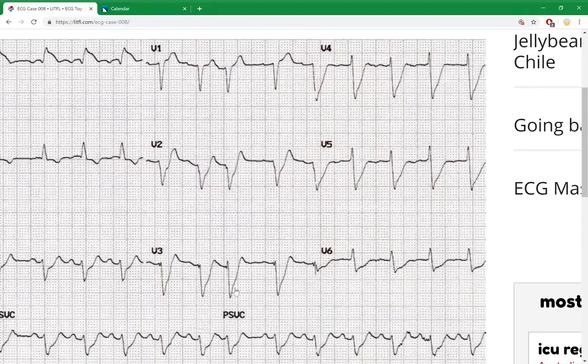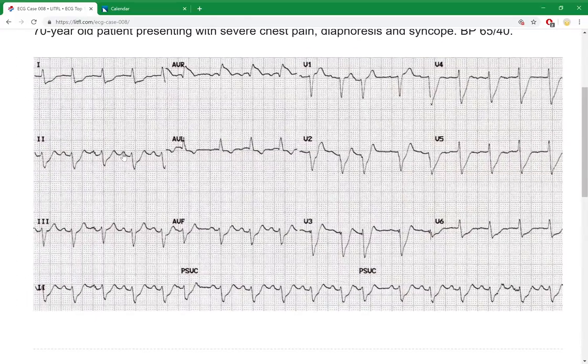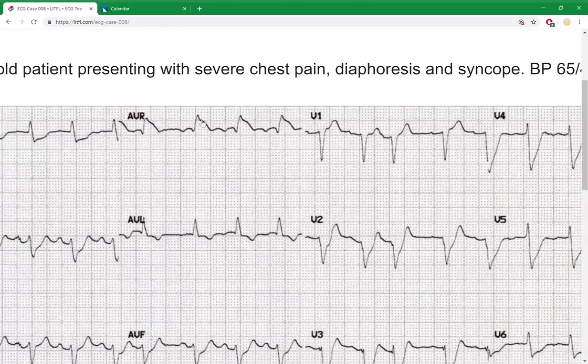So you can kind of see now where the ST segment begins. So we have severe ST depression here, here, here, here, here. So V2 through V6, severe ST depression, inferior leads right there. This is the ST segment, severely depressed. aVF, severely depressed. I, severely depressed. Now, so basically we have ST depression everywhere, and aVR has severe, severe ST elevation, like almost 5 millimeters above.